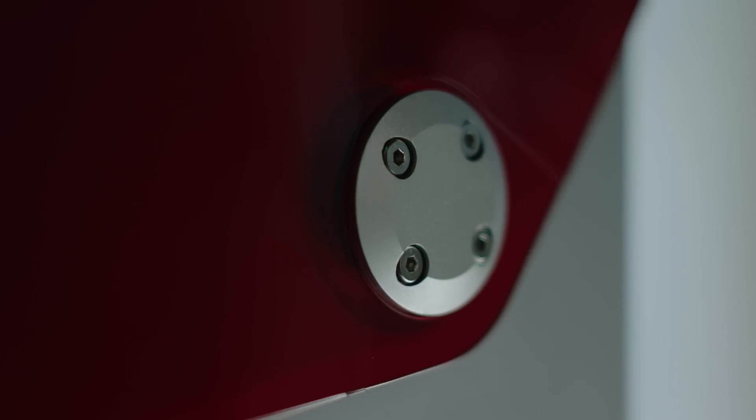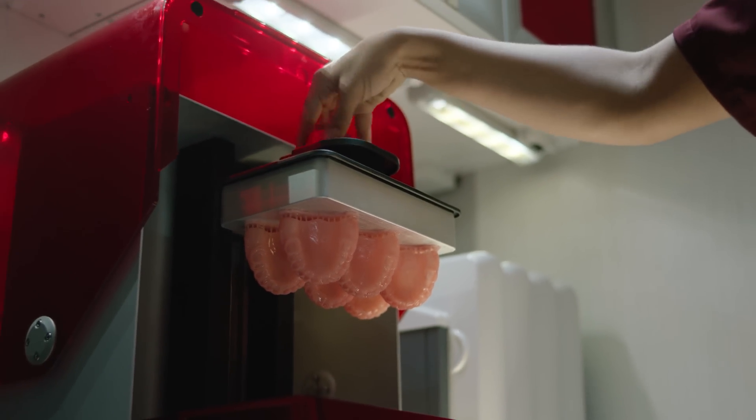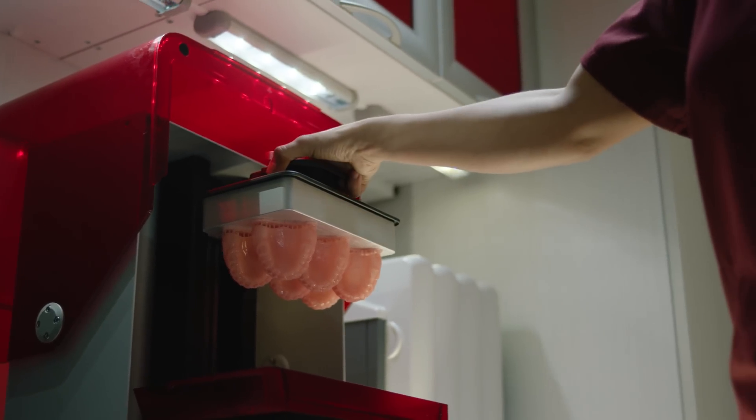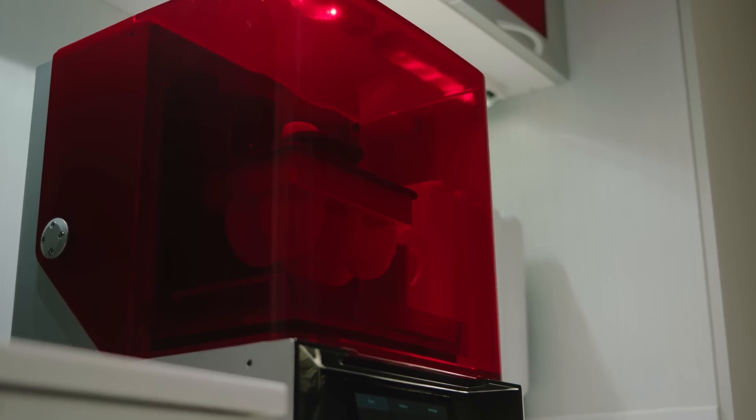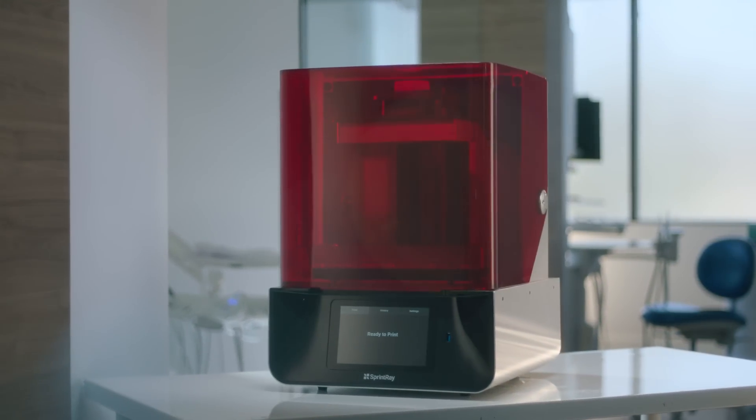With the Sprint Ray Pro, 3D printing will become the easiest task in your office. Best of all, the 6-core CPU is powerful enough to handle these tasks today and whatever comes tomorrow. Bring your practice forward and be a part of the next 100 years of dentistry with the Sprint Ray Pro.